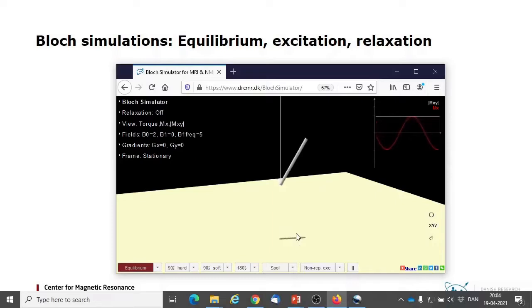The MR signal is shown in the upper graph. The red curve is the coil voltage generated by the precession, and the white constant curve is the signal amplitude corresponding to the length of the shadow on the floor.